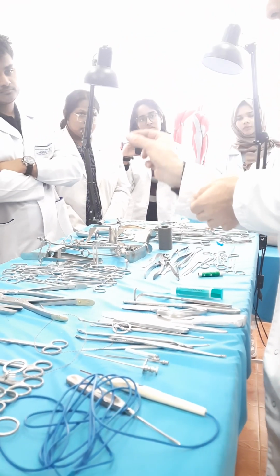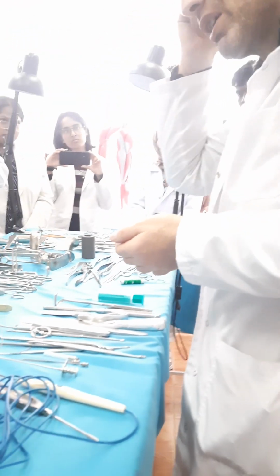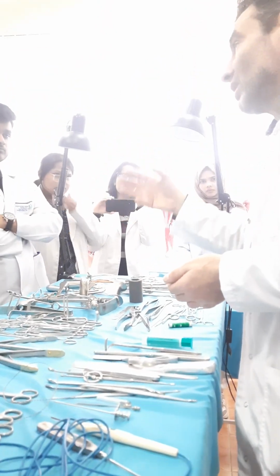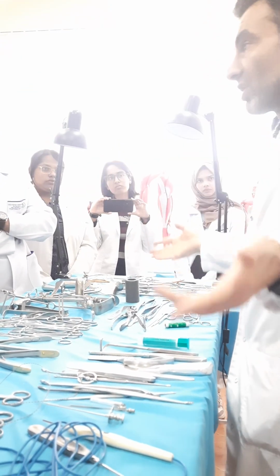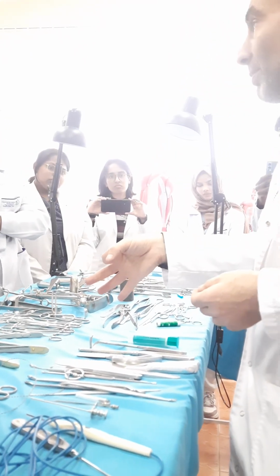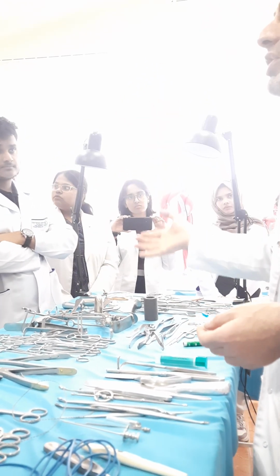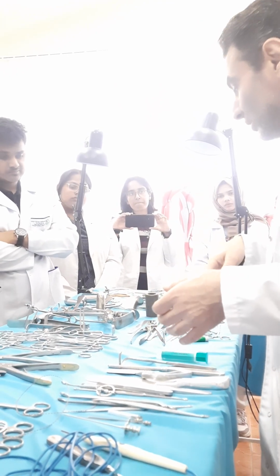But one problem, it makes a big defect of the bone. Let's say, for example, if you make craniotomic trephination, it means you will replace the bone, so don't use it. If you make an ectomy, removing the bone forever, like a radical surgical performance, that is great, you can use it. How do we do it? Generally, you make one aperture, and with the Dahlgren you start to enlarge it to all sides, for example, to reach 6 by 6 centimeters. You increase the diameter using the Dahlgren.